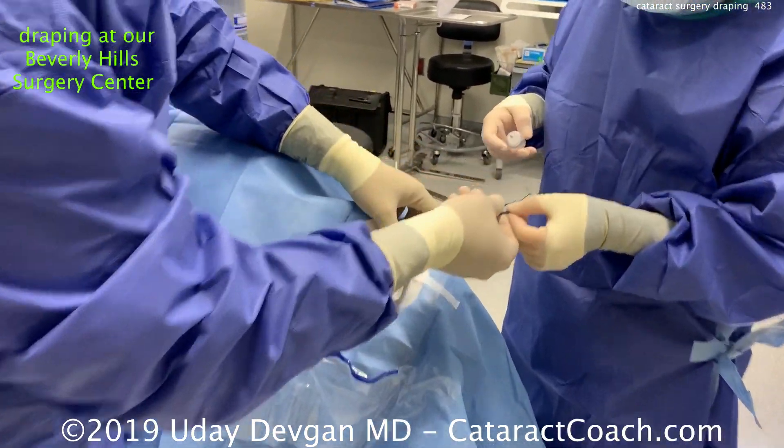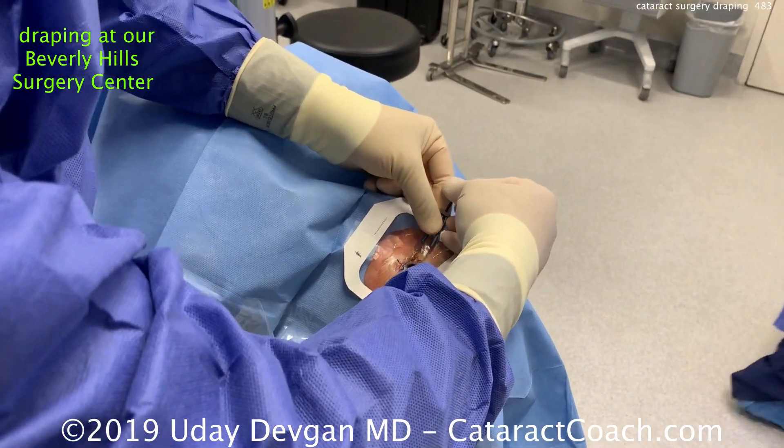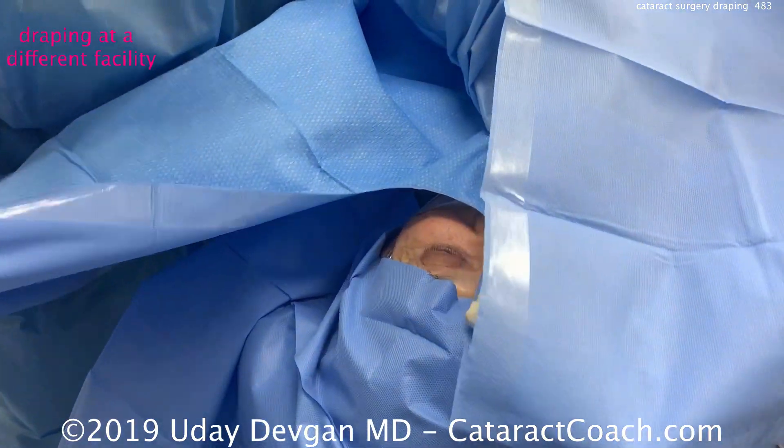We'll do it for the lower lid as well, and so without touching the skin at all, we're able to drape it so that every single eyelash is out of the way and there's a clear plastic drape around the lid margin.